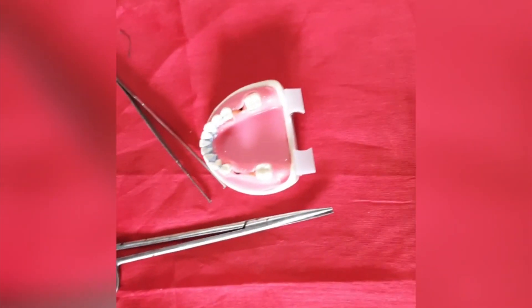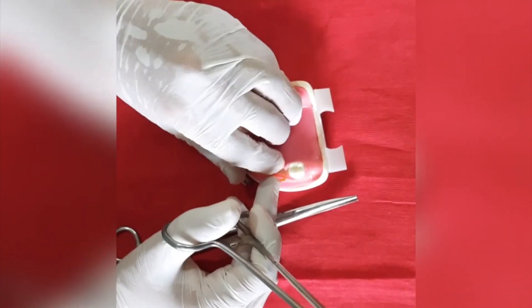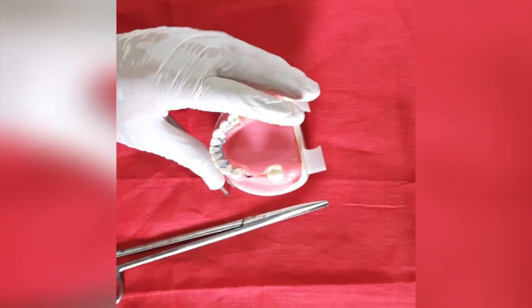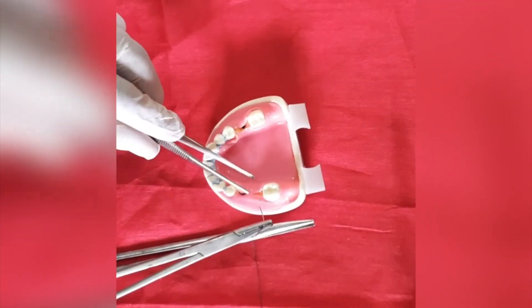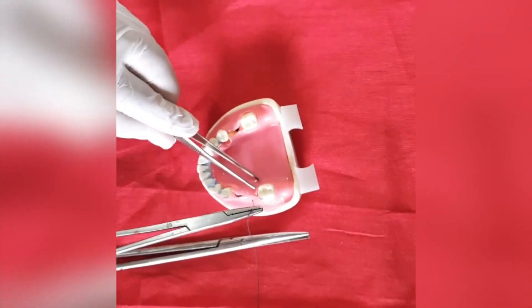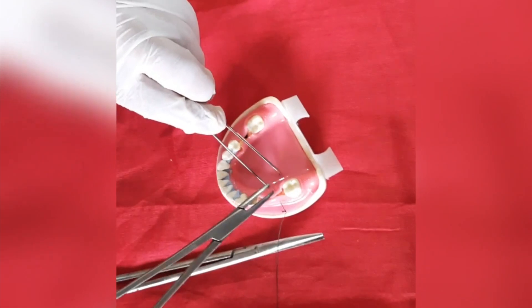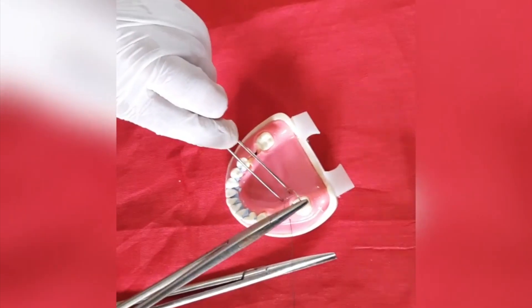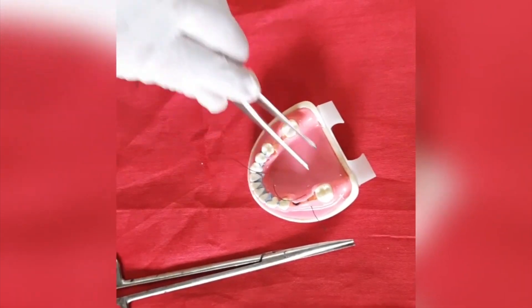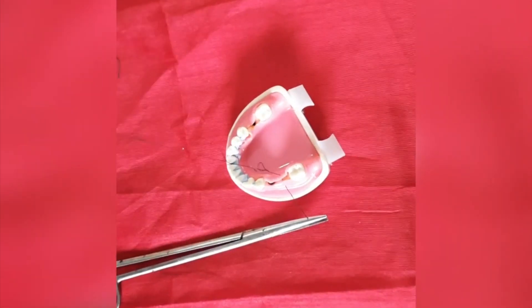The third type is the figure of eight suture. It is used in large areas — for example, here one extraction is done and one implant is placed, so we will use the figure of eight suture. First hold the needle and enter it through the tissue at a 90-degree angle, then bring it out from the other side. Pull out the thread and keep some extra thread on the other side to help you make the knot easily.